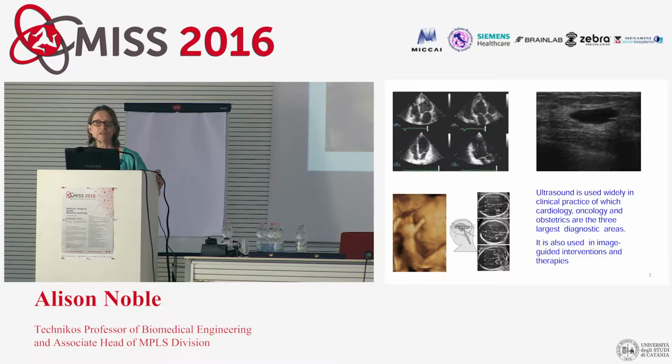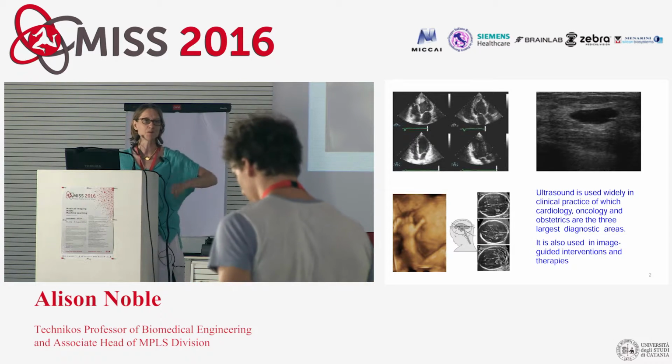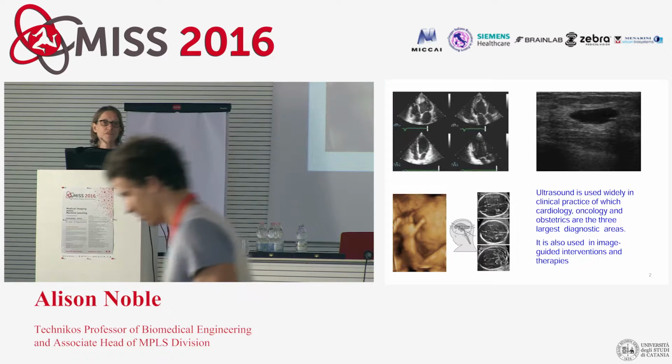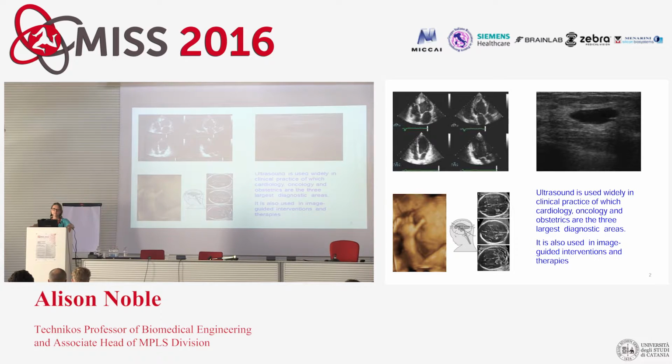And they navigate with essentially a torch. They're going with a torch inside the body, trying to find certain structures. They're highly skilled people, and there's a degree of training that has to go in to be able to do that. Everybody out in the audience today doesn't have that training, which is why in most papers you'll see people talk about ultrasound being low quality, noisy.